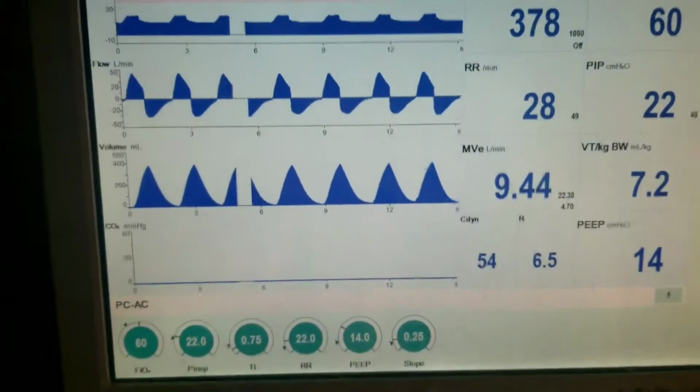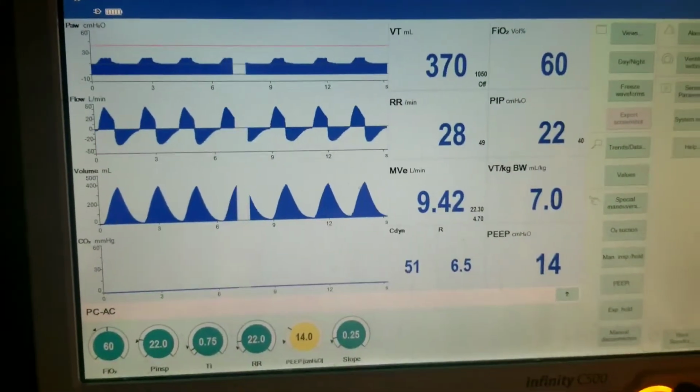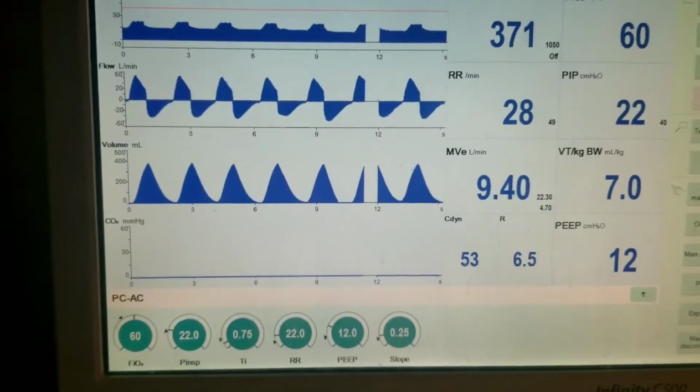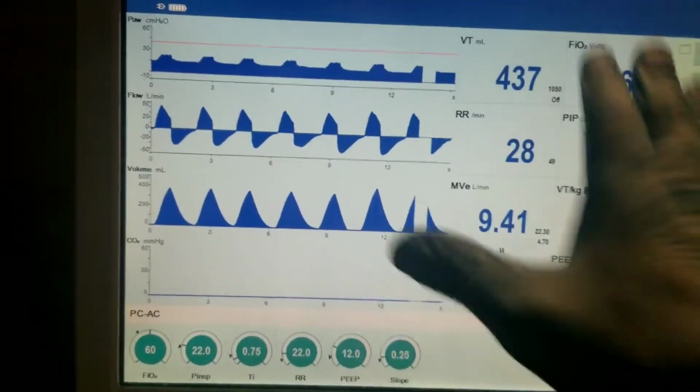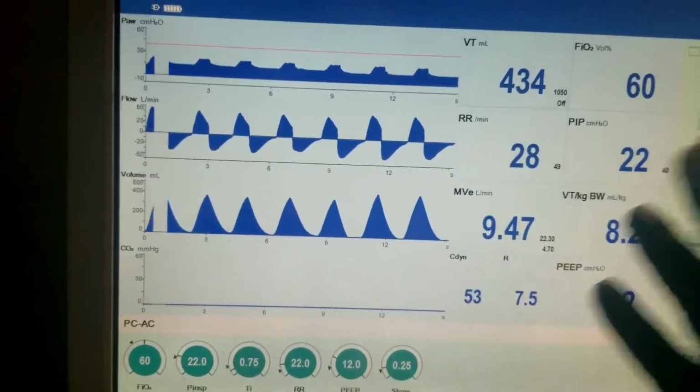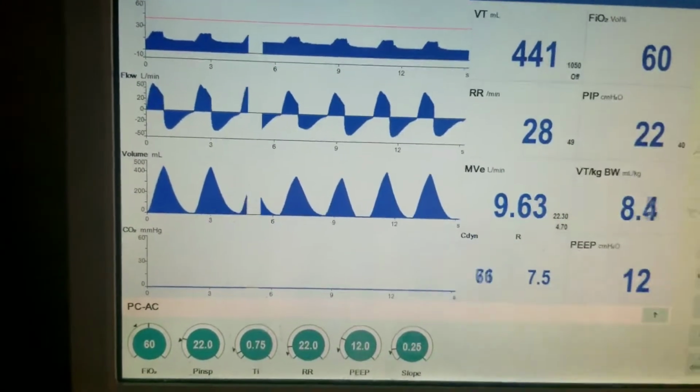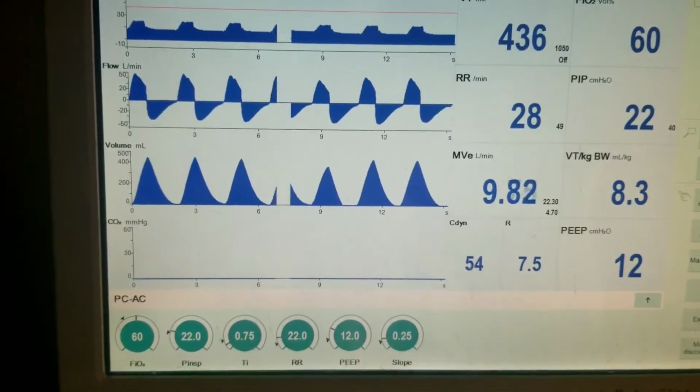All right. Let's go back down now to 12. We're going to go down to around 6, unless it's quite obvious that we're seeing indications that, let's say at 8, it's already getting worse. We'll decide with the feedback from the vent how low we'll go.